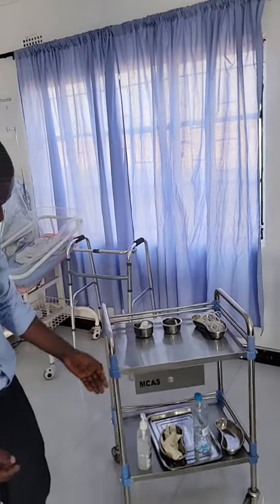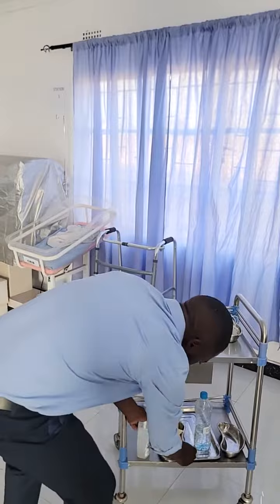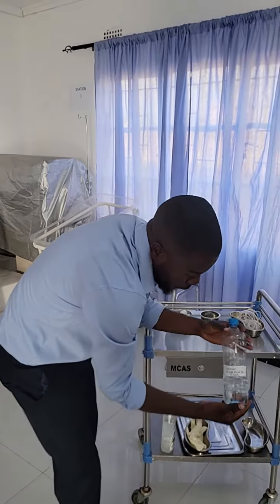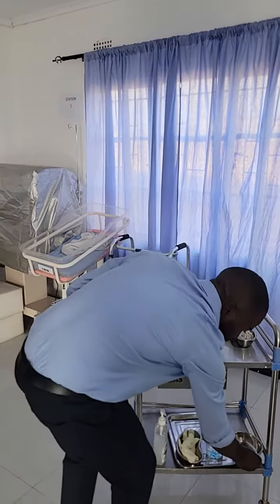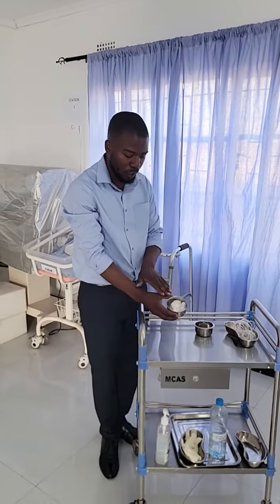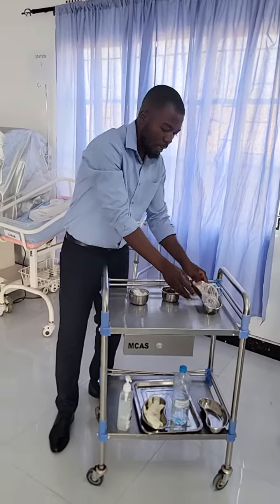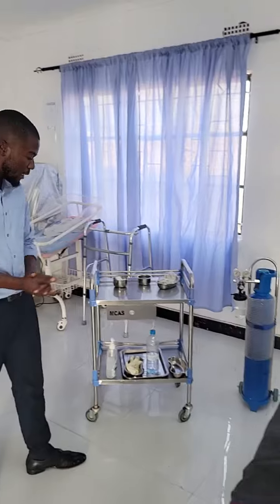Let me also introduce what we have on the trolley. On the bottom shelf, we have hand sanitizer. We also have a receiver with gloves. We also have sodium bicarbonate and a receiver where to discard the used swabs. We also have a receiver on the top shelf, with the galley pot with cotton, another galley pot, and a receiver with the nasal prongs. And then we have the client that side.